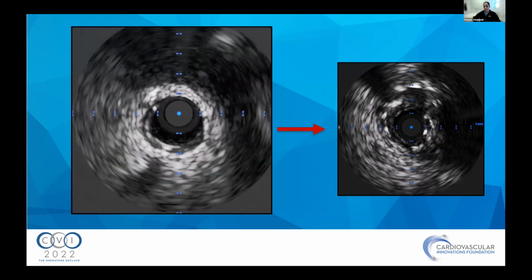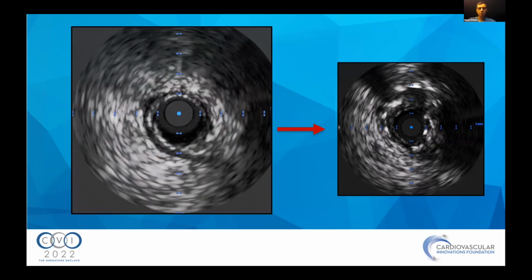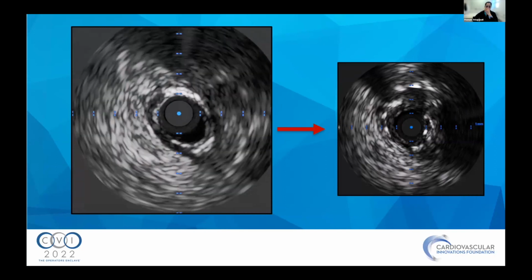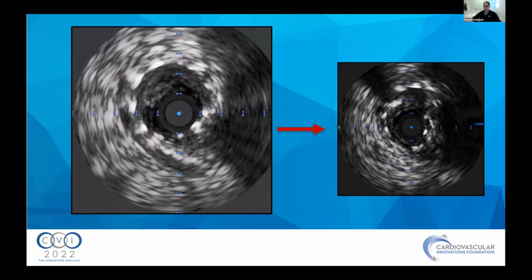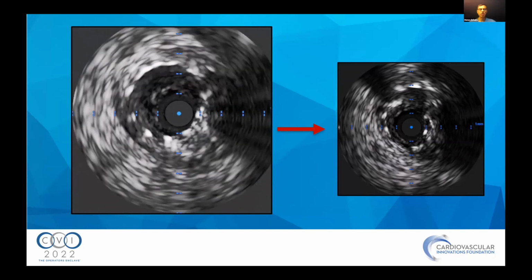So at this point, Poonam, do you have brachytherapy at your place? We do not. We send them out, but this was only one layer of stent. If we stent now, this would be a second layer. So I think we still have some ways to go for brachytherapy, don't you think? Yeah, absolutely. Just thinking in the future.